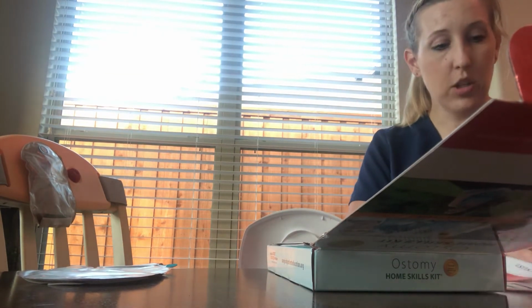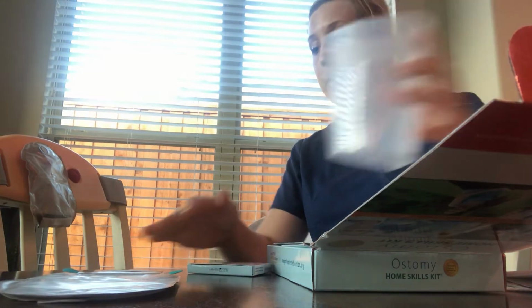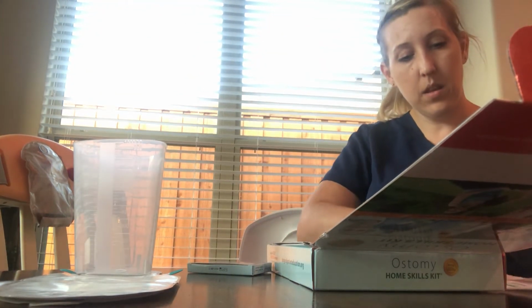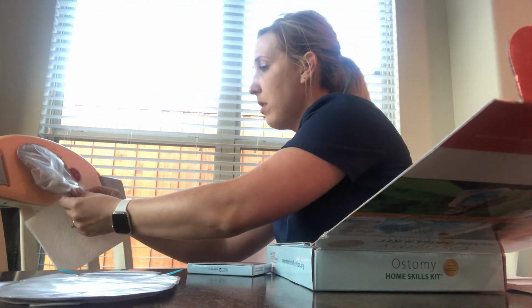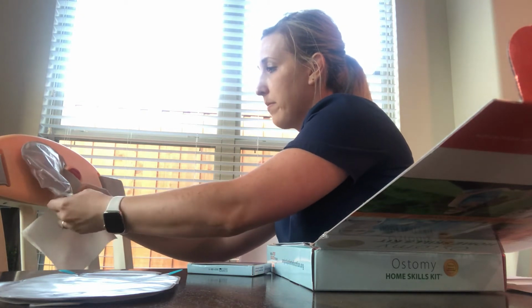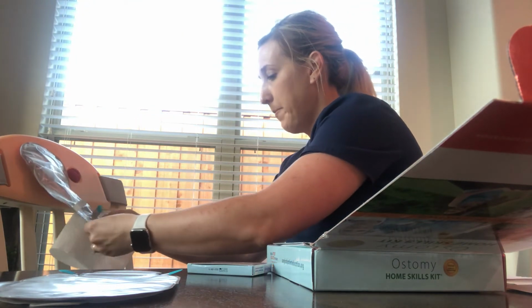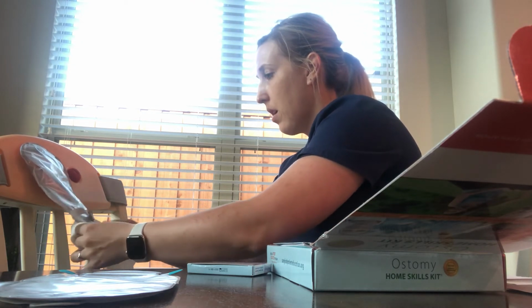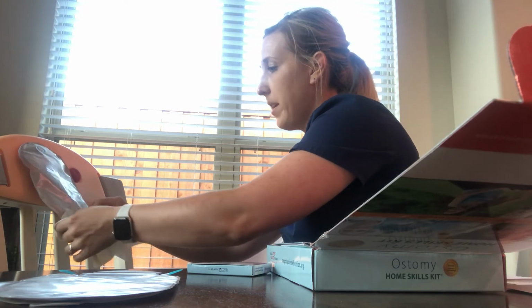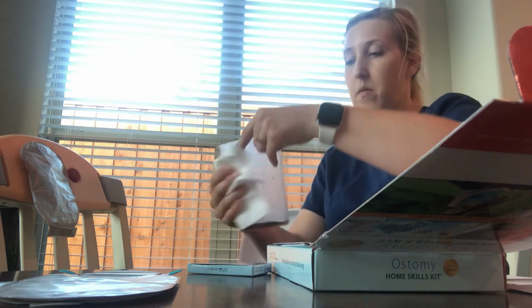So when removing your pouch, you're going to want that peristomal cleanser that I was telling you about. And you're going to want your cylinder, and you're going to want your paper towel. You're going to hold your paper towel under the backside. You're going to make sure you have your cylinder available. You're going to unfold. You're going to undo your Velcro here. You're going to unfold again, and you're going to let it empty. Once it's emptied, you can kind of fold this back up a little bit. And then you can set this to the side and dump in a little bit.